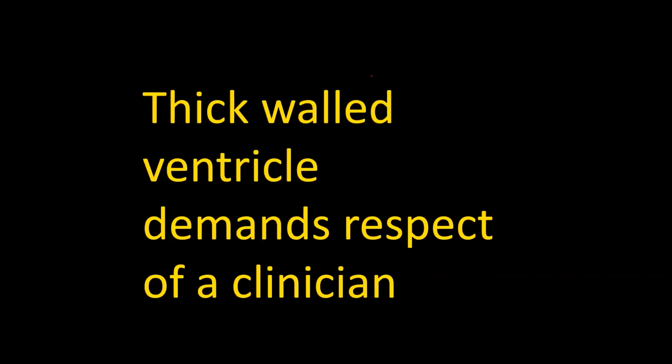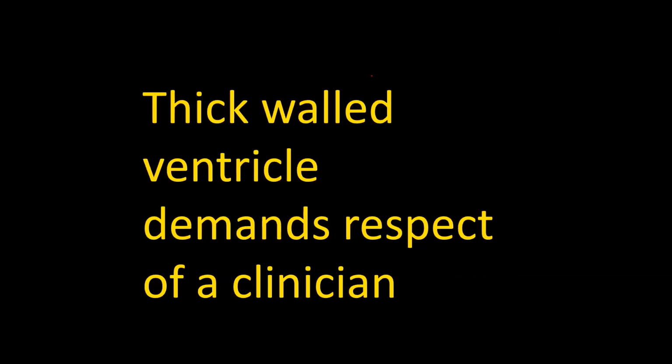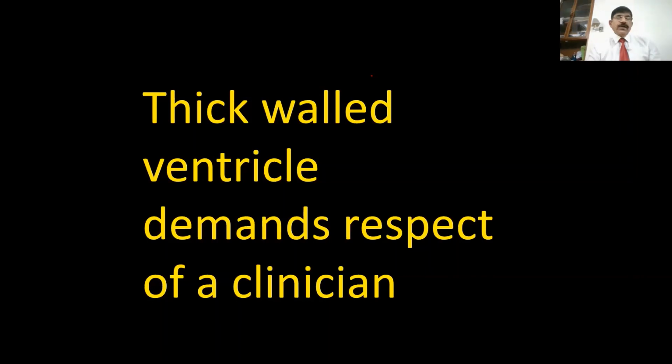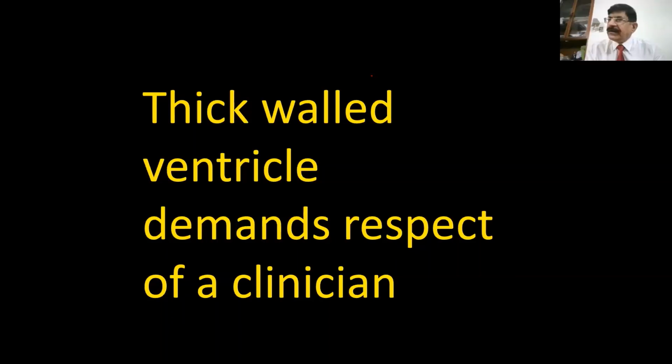Perfect, sir. So, Mohammad Rabiul wants to know if we do have a normal value of LV wall thickness in the Indian population. Can I suggest that I published a paper in Indian Journal of Medical Research, normal wall thickness in Indians, 50 women and 50 men of all ages, somewhere 30 years back. I would suggest to read that paper.